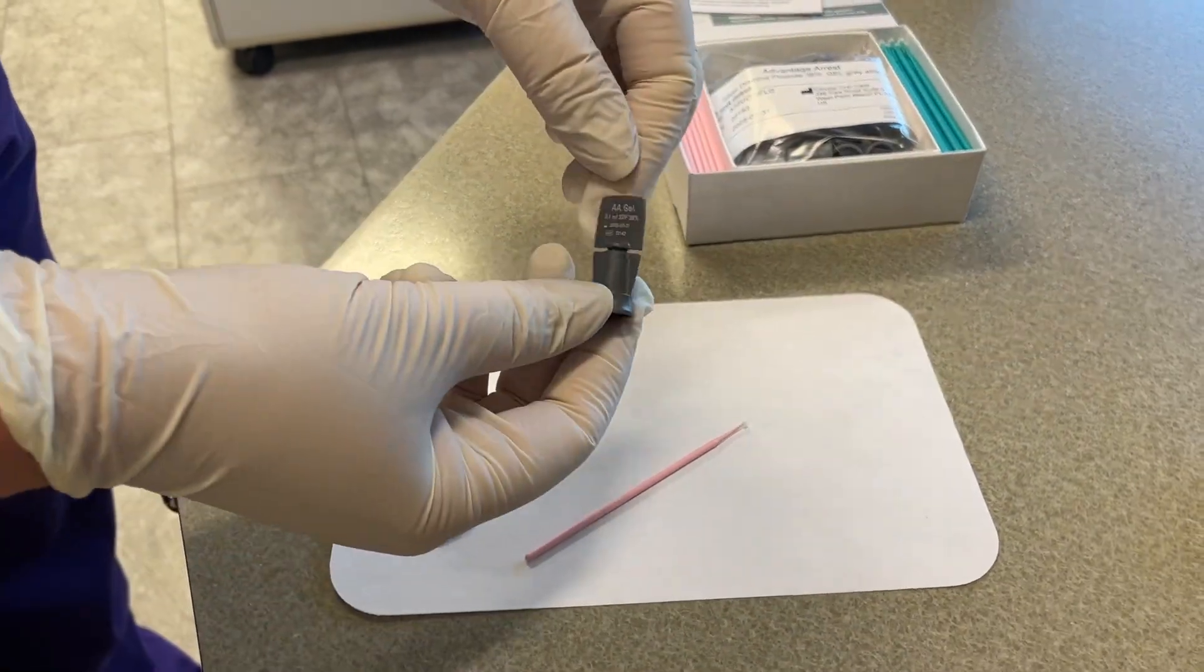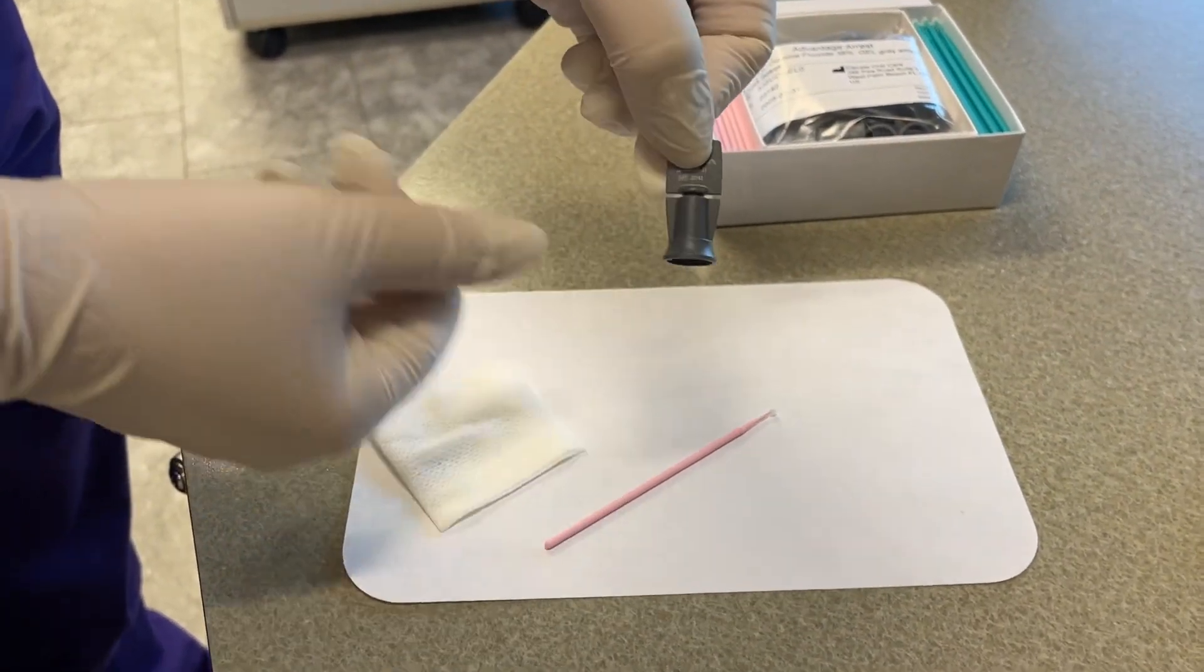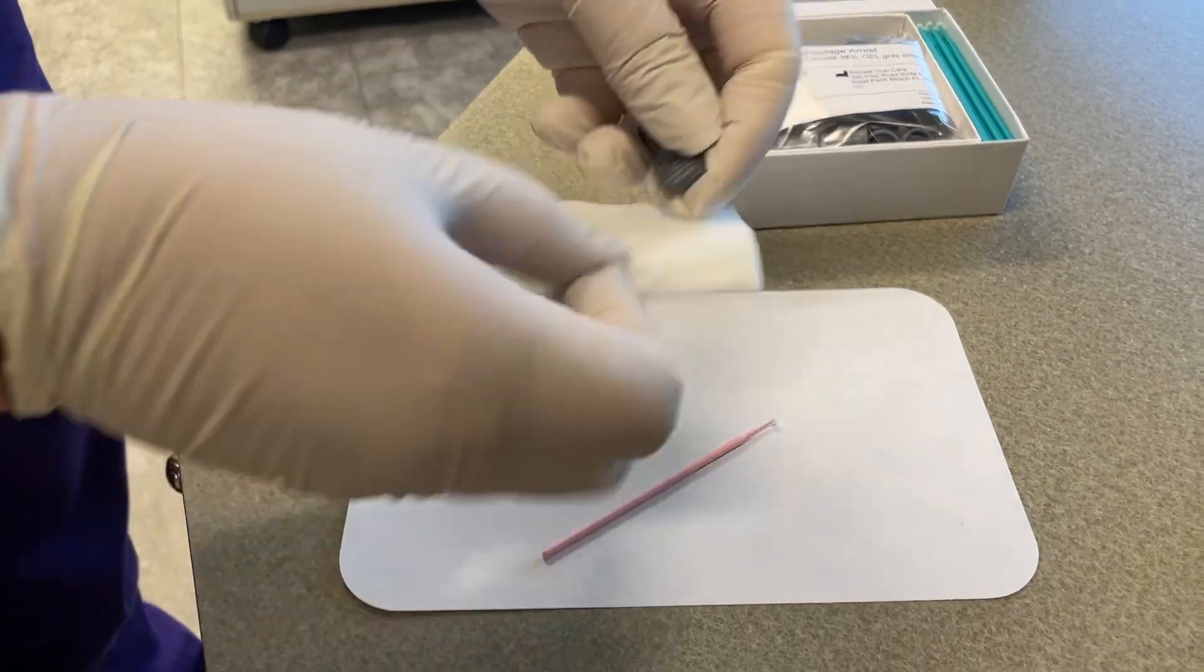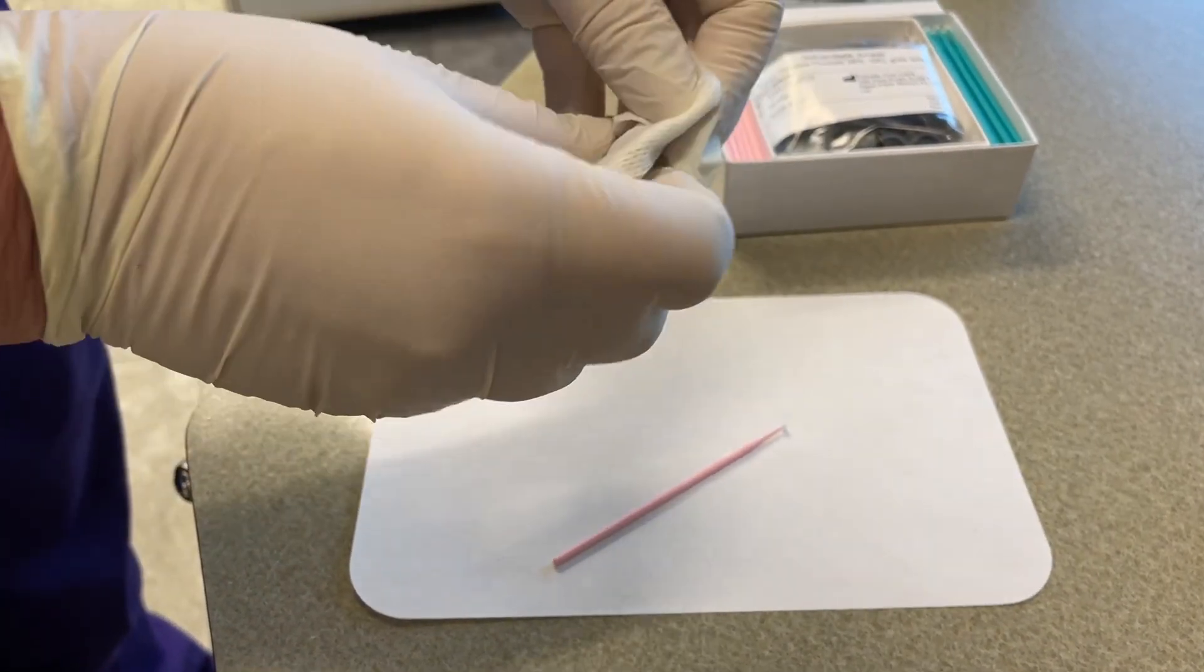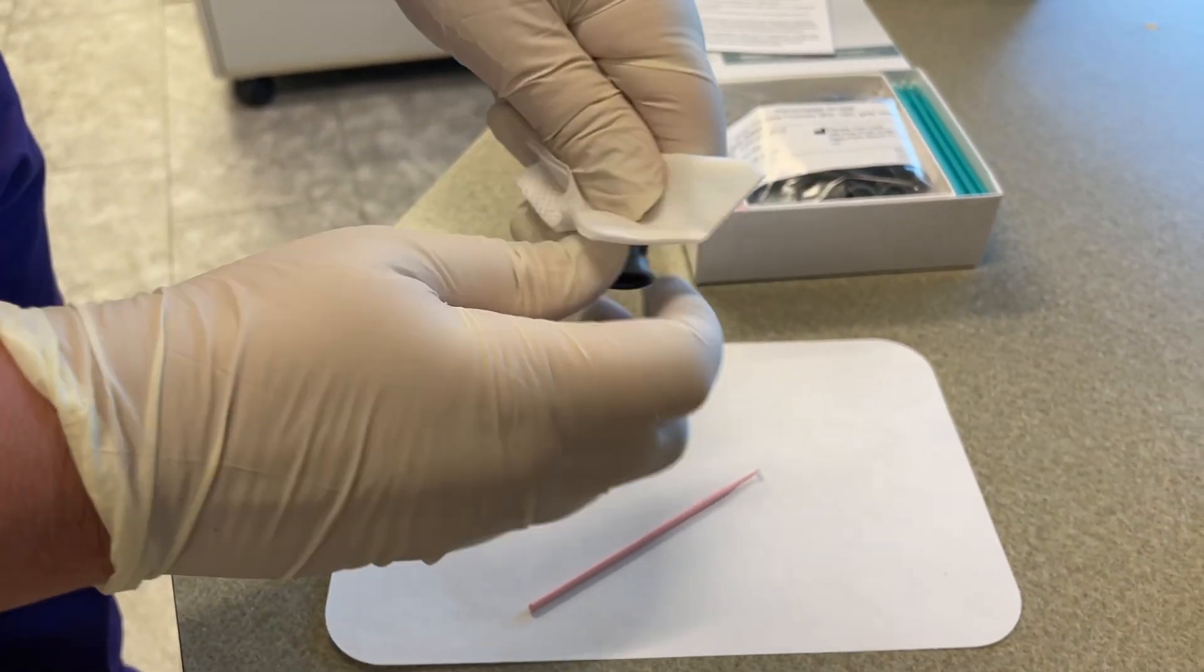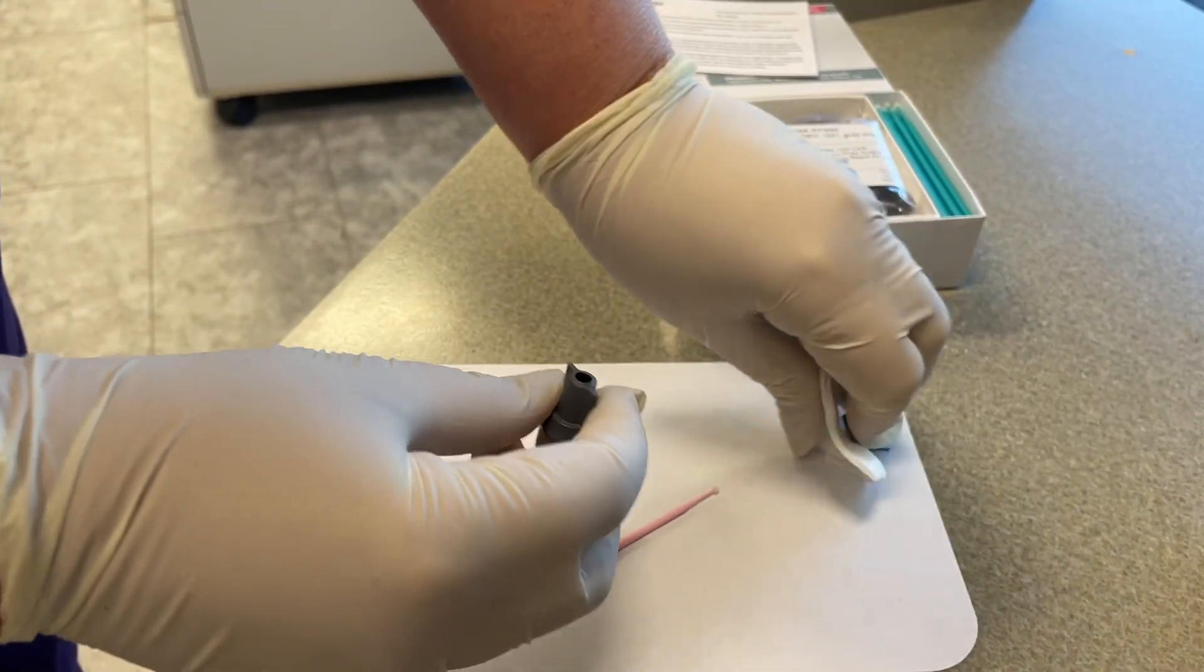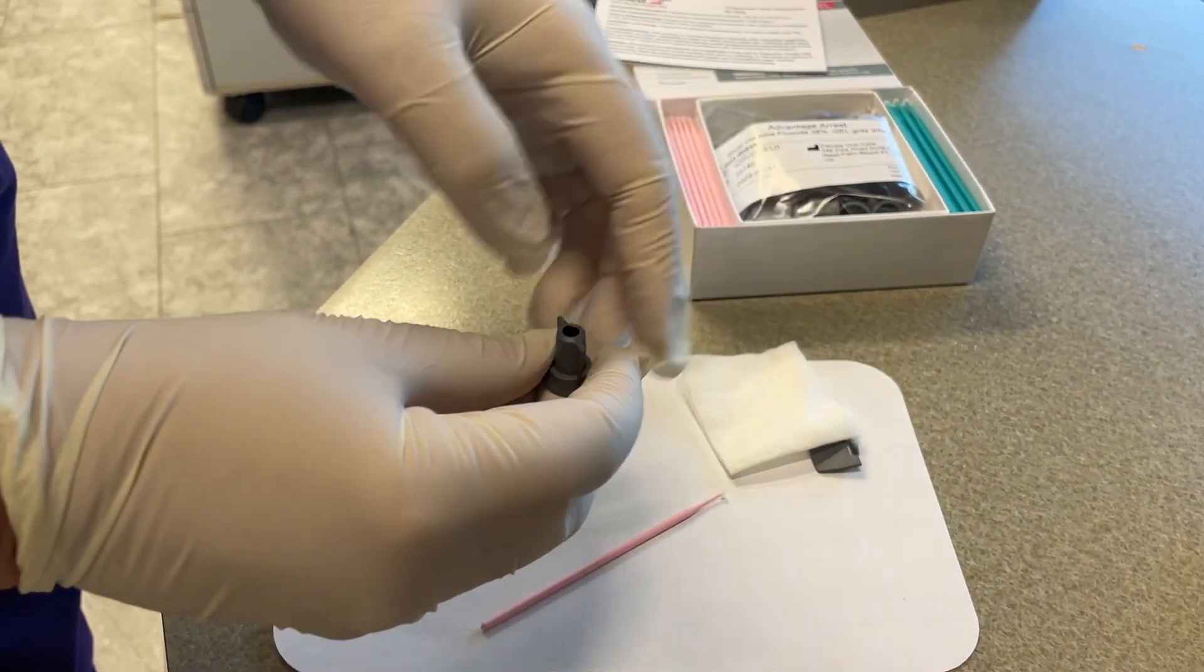I have one of the little ampules out. This will treat up to five sites. You open it by covering it with a little 2x2 gauze so it doesn't get on anything else. Of course, wear gloves and be careful where you put it.